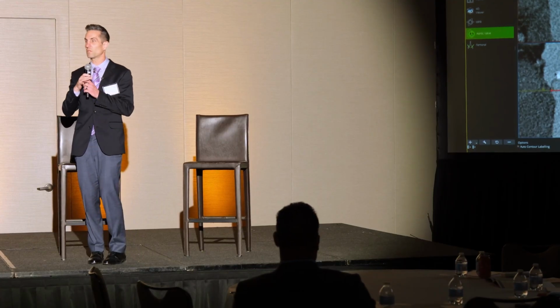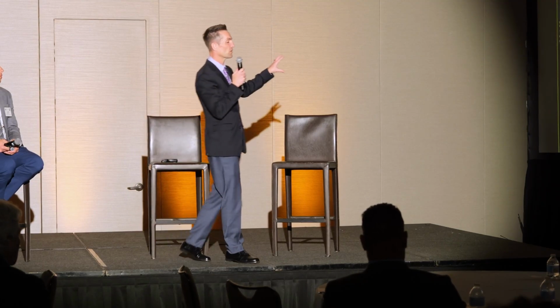And one of the things we wanted to do with this kind of environment is to demystify a little bit or open up the images that are obtained, because there is, and we talked about it earlier, a lot of value for patients in seeing these types of images, especially the curved planar images, and for primary care to have the ability or control to be able to show these types of images and know the terms or the lexicon to communicate those.